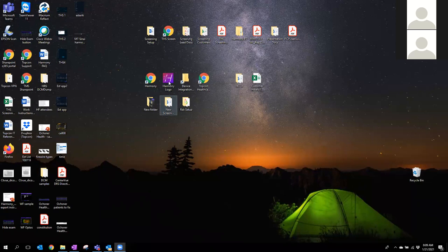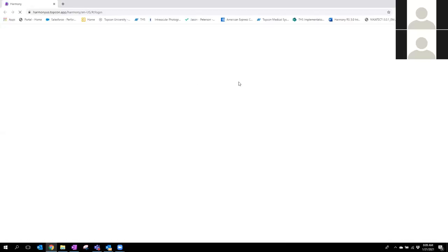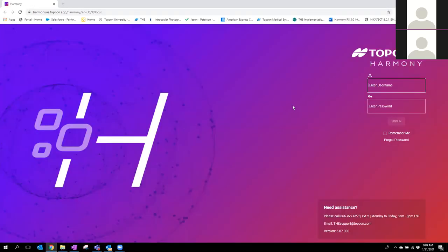Things like OCT, visual fields, cornea analyzers, and fundus cameras are all going to be exporting images and exams to one place. Harmony is fully web-based. Right now I'm going to be showing you a demo site of Harmony from its own perspective. How it's going to be set up when you go live — it's going to be accessible via hyperlink through your EMR. You'll be going into the patient chart and you'll see a Harmony hyperlink. When you click on it, it logs in for you and goes right to that one patient chart.